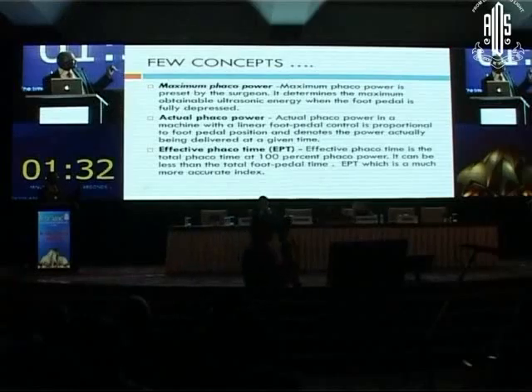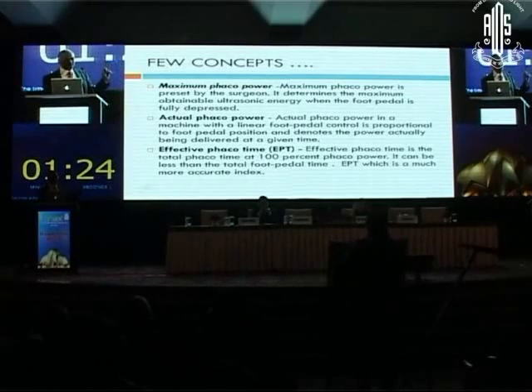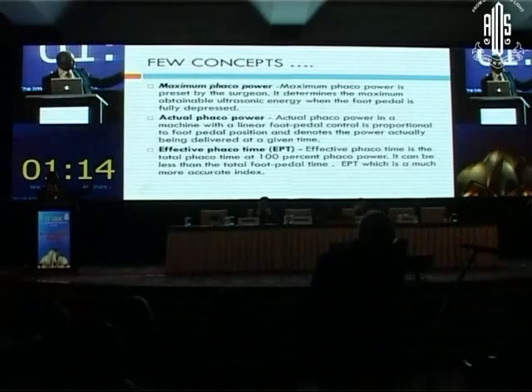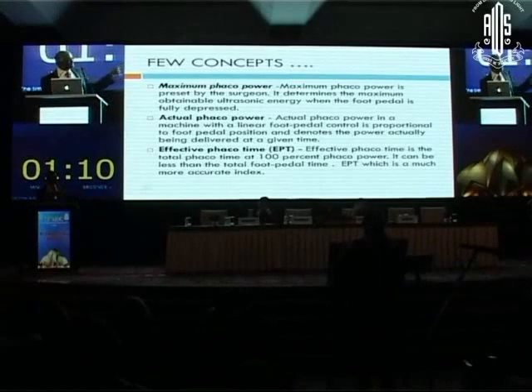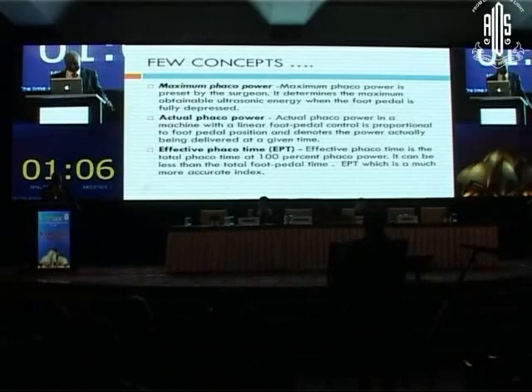The effective phaco time, EPT, is the total phaco time at 100% phaco power. If your phaco power is 50%, that is measured against 100% and then calculated, and it can be less than the total pedal time. So EPT is a much more accurate index when you are thinking of the use of phaco energy.